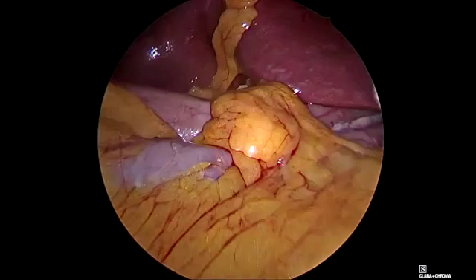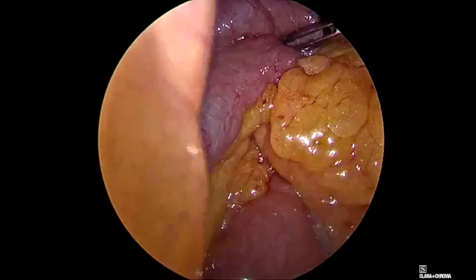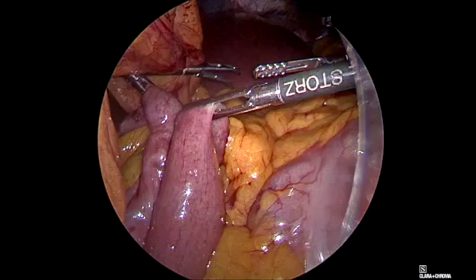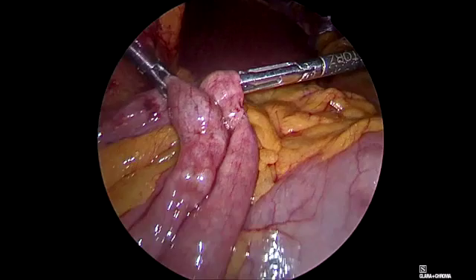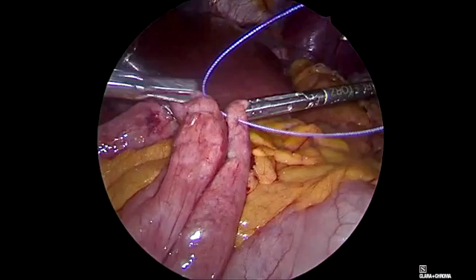Now we are going to select a point 30 to 40 cm below the gastroileal anastomosis to make a lateral-lateral mechanical anastomosis. Then we will show how we do it in a terminal-lateral mode. But here it is going to be lateral-lateral. This is a presentation suture — it facilitates the insertion of the arms of the stapler in both sides of the limbs.